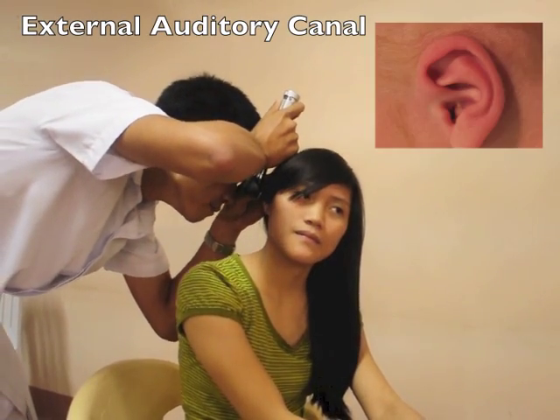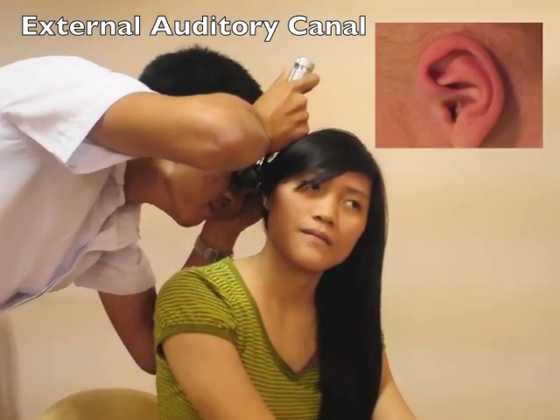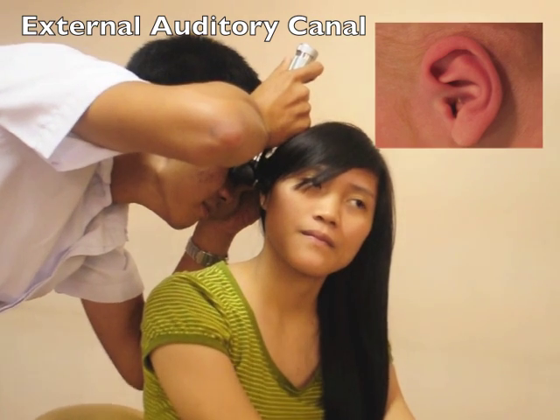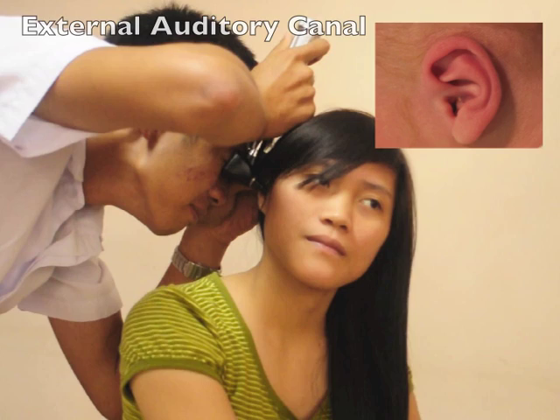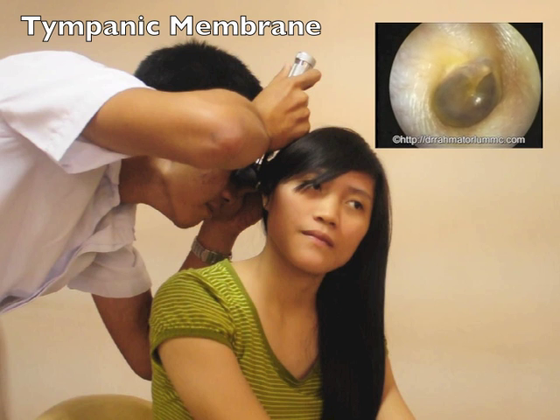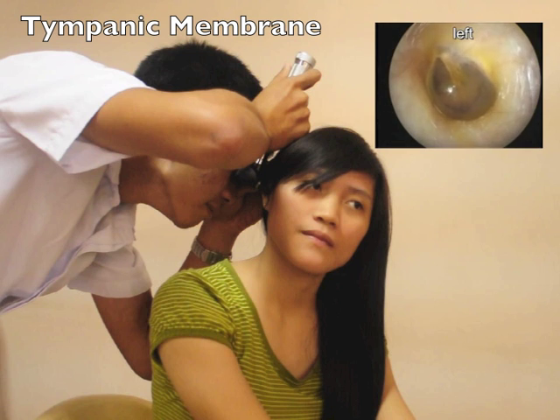Look before inserting the speculum into the external ear canal. Insert only in the outer third of the canal. Note for color, drainage, and lesions. Note the color, position of landmarks, and intactness of the drum. Never irrigate the canal unless you are sure the drum is intact.